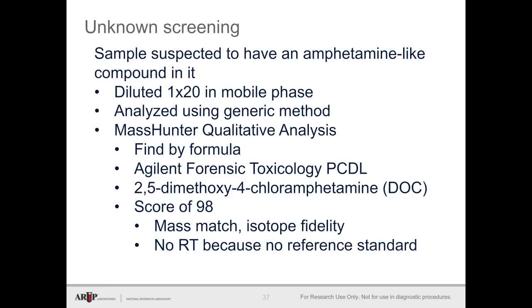Time of flight is a very powerful tool when it comes to unknown screening. A biological specimen was suspected of having some sort of amphetamine-like compound in it. My medical director gave it to me and said, "Here you go, have fun." I love troubleshooting and solving mysteries, so I happily ran off to the laboratory to work on the QTOF. I diluted the specimen in mobile phase at a 20x dilution, and then I analyzed it using a generic method, probably a C18 column.